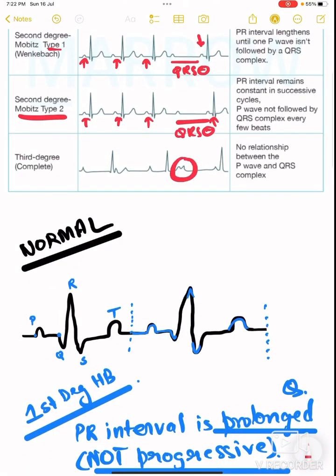Lastly, T superimposed with P, right? QRS happening with P, anything is happening, everything is chaos. Third degree heart block, most important, Lyme's disease, right?